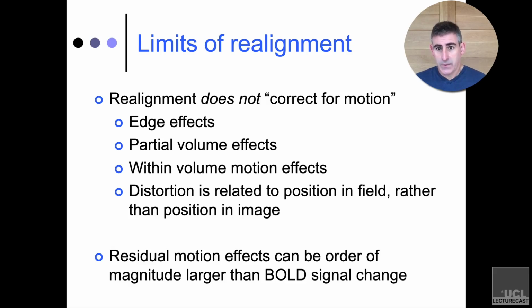So one of the things that's important here is that we're doing this process to try to get rid of this source of variability in our data that's due to the fact that people are moving their head, right? And almost always people refer to this as motion correction. Multiple times, I've talked about correcting for some of this motion. But I don't like the term motion correction because it implies that it undoes all of the effects of motion. It does not. It simply realigns the data.